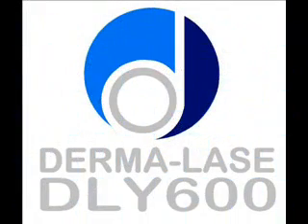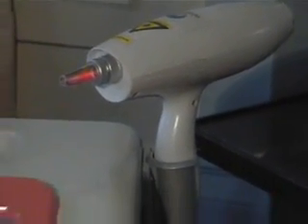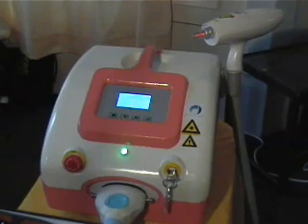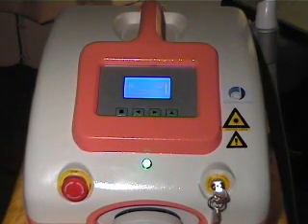The DLY ND YAG 600 laser is a Q-switched neodymium YAG system designed to treat tattoos and benign pigmented lesions. The DLY 600 is very easy to operate whilst also being very portable. The whole unit weighs less than 20 kilos and is supplied with a metal flight case to protect it during transportation.